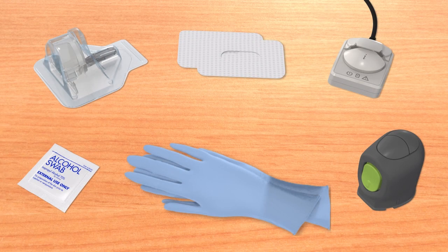First, gather your supplies: an alcohol wipe, gloves, an NLite Sertor, an NLite Sensor, overtape, and an iPro2 Recorder.